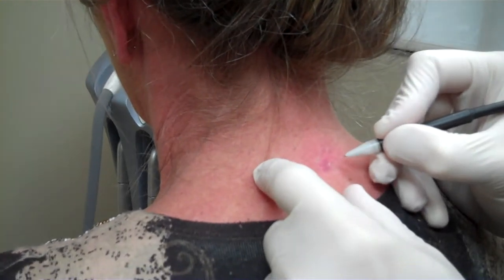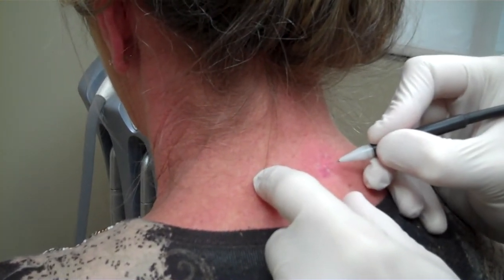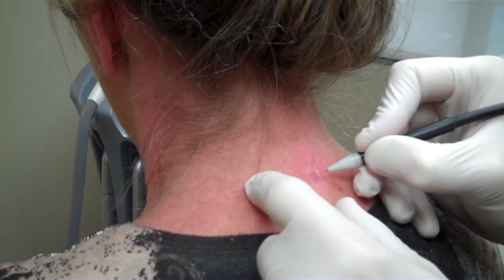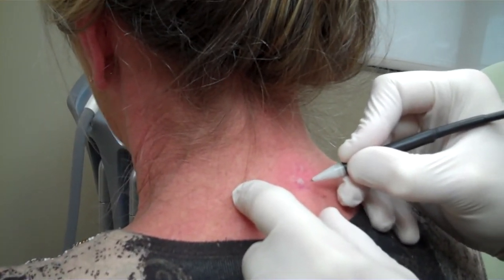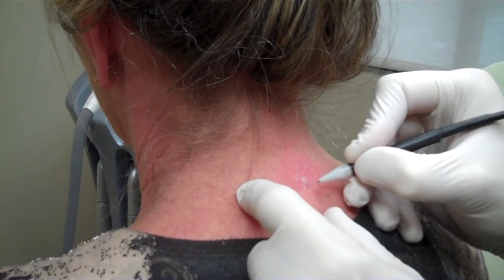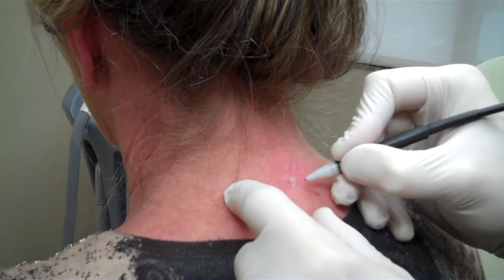We removed about 95% to 98% of it with the first treatment and this second one is just going to get rid of this last little bit of vessels that was under. It will kind of whiten up a little bit and then after a couple of days when it all heals up it will be completely gone.